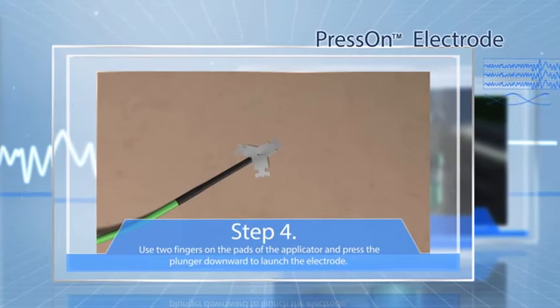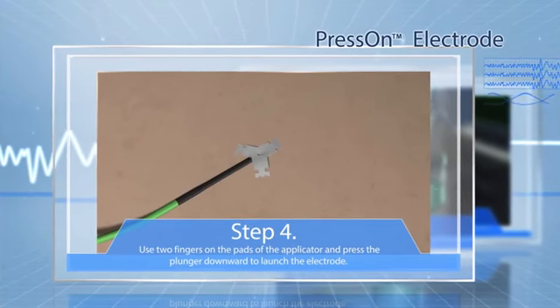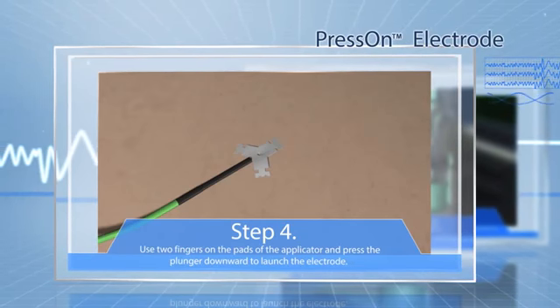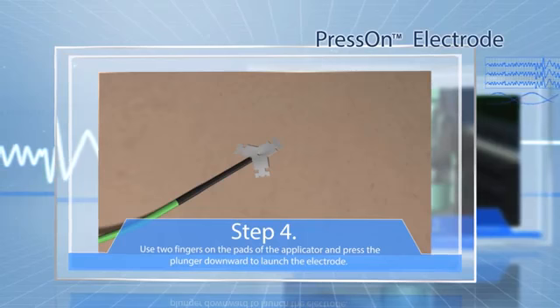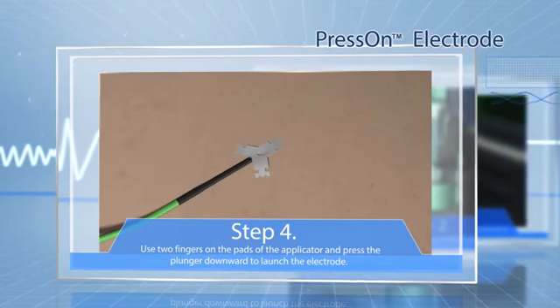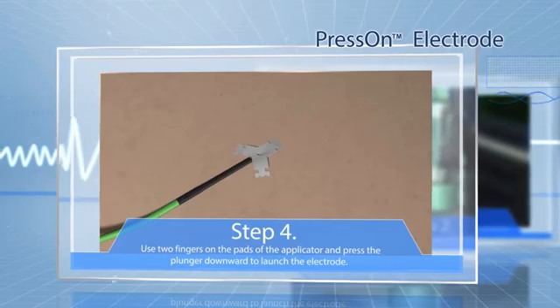Check to ensure the electrode deployed into the patient and is securely in place. If desired, cover the electrode with medical tape and utilize lead wire strain relief techniques to secure the placement. Discard the applicator.